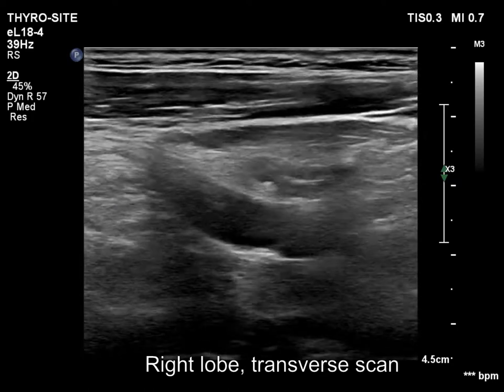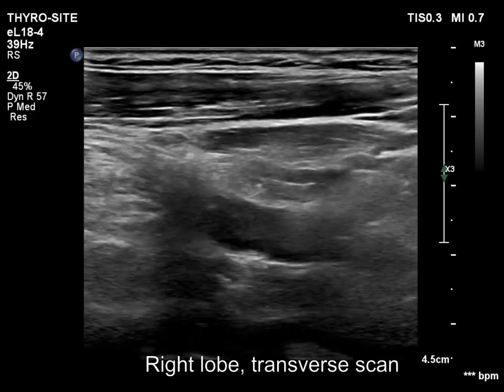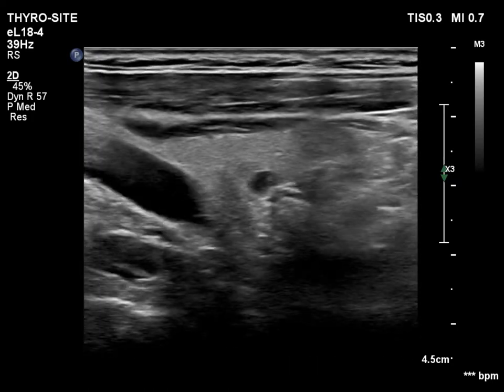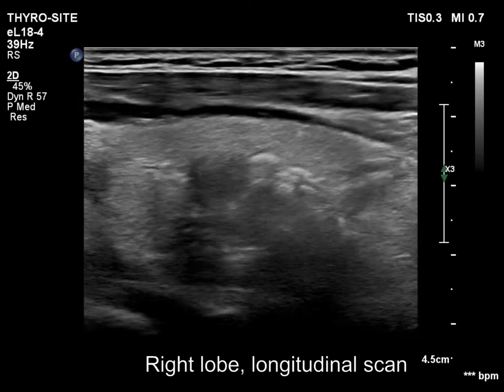The right lobe is ecnormal and has several moderately hypoechoic discrete lesions. These are not suspicious.